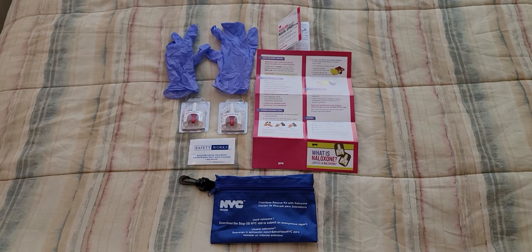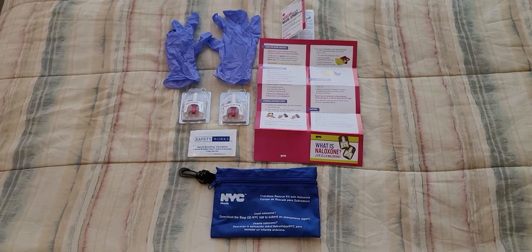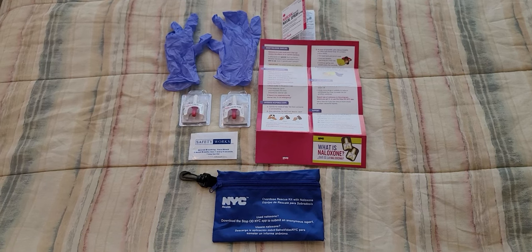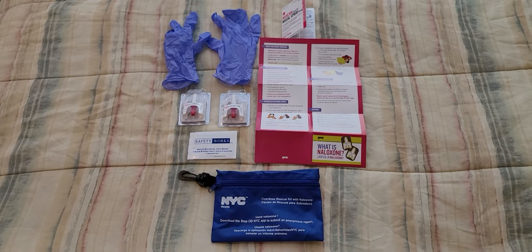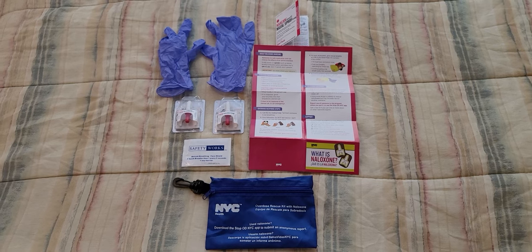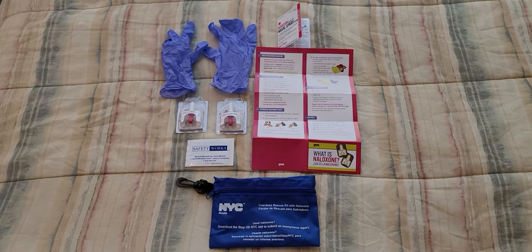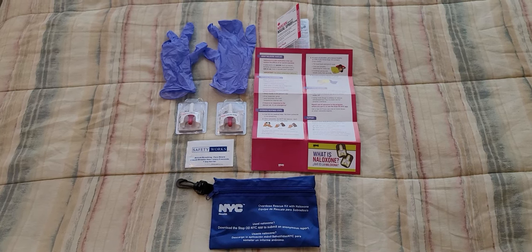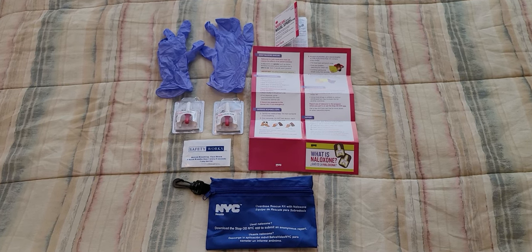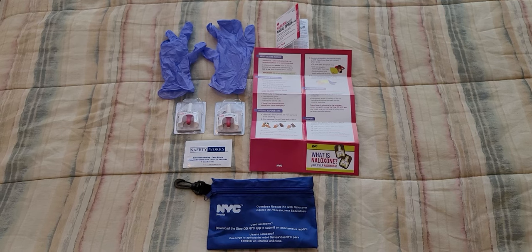Welcome to another tutorial video. In today's episode I want to show you guys how important it is to learn how to use the Narcan kit. Whether you are a security officer, fire guard, EMS, EMT, firefighter, paramedic, police officer, or if you have a kid of your own or know anybody that suffers from opioids, this is a good method to learn and explore.